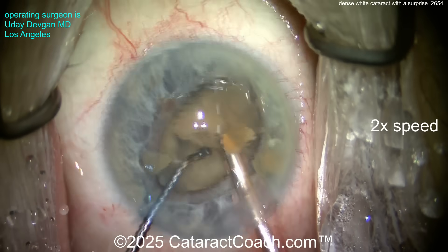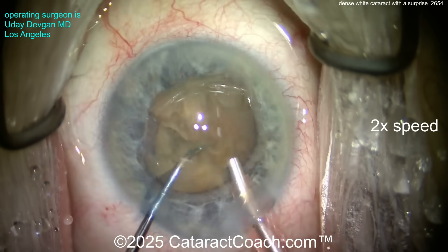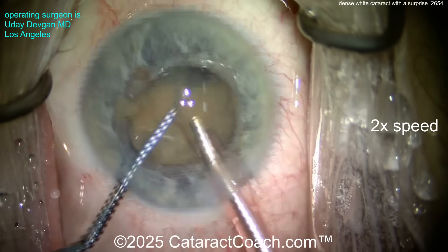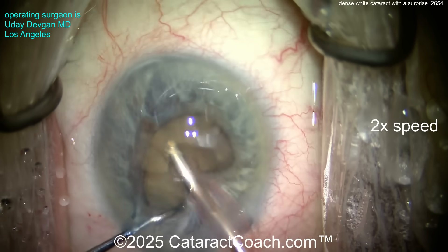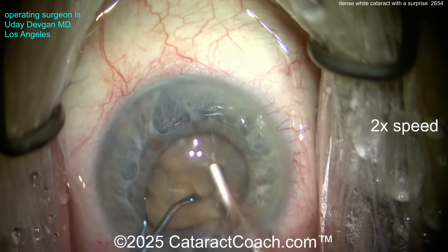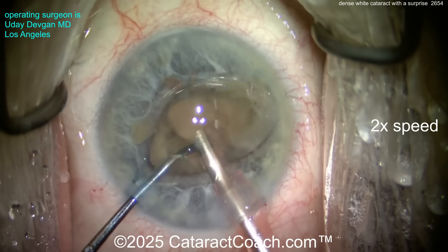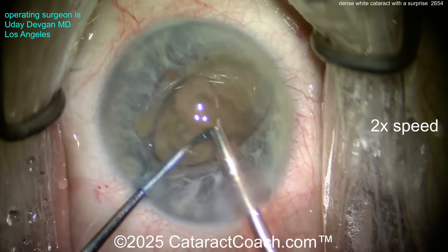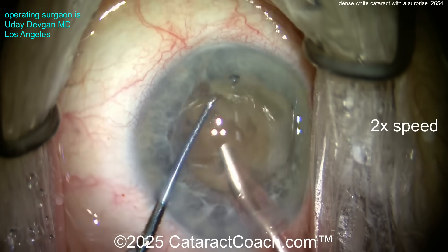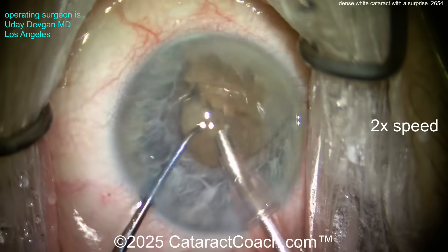Chop and chop — just want to chop up little bits at a time. The technique here is to take my time, go nice and slow. We're using phaco power modulation trying to minimize energy. We may have to recoat the endothelium. Watch that iris — it wants to even prolapse through the paracentesis. You could put iris hooks in or a pupil ring, but if you don't need to, you don't need to. Just chopping it up.